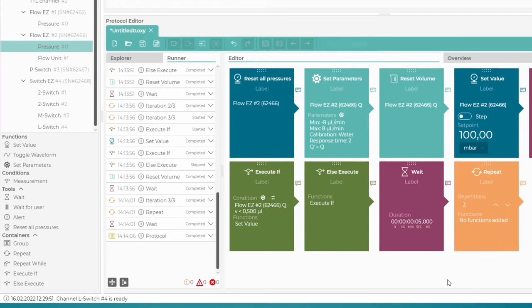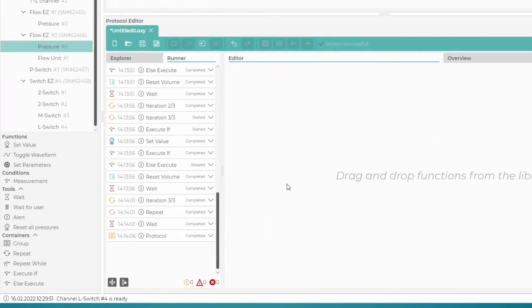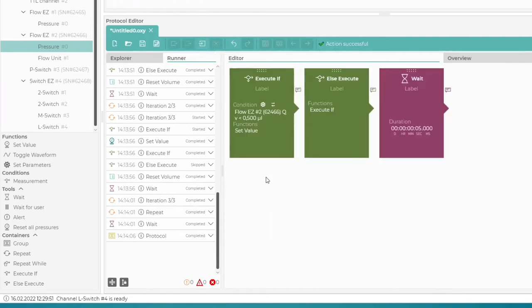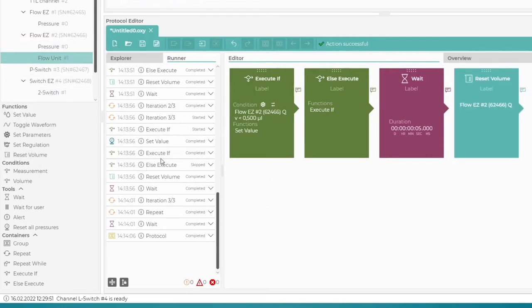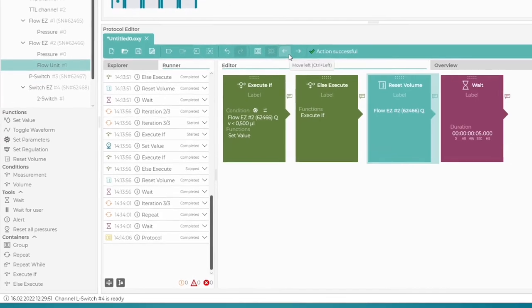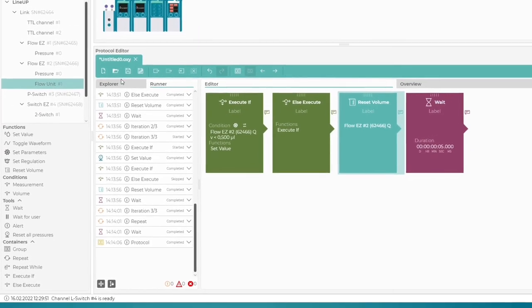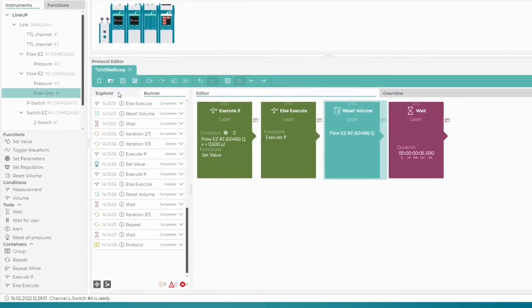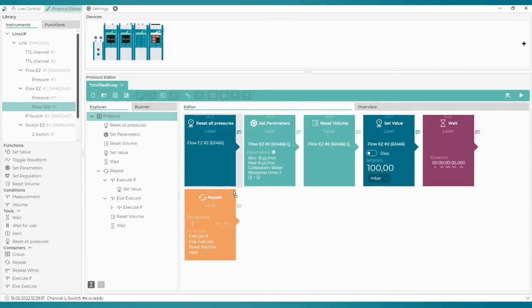Let's cut and paste our recent blocks into this container. Do not forget to add a block called Volume Counter Reset before the pause, to make sure the measurement starts from zero again. This is what our protocol looks like now. Let's run it.